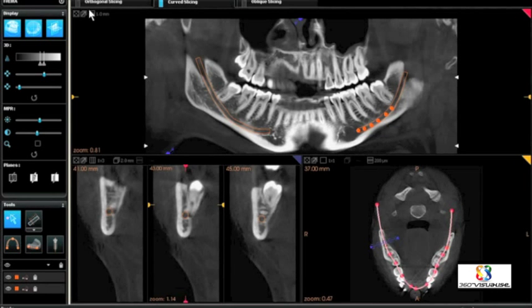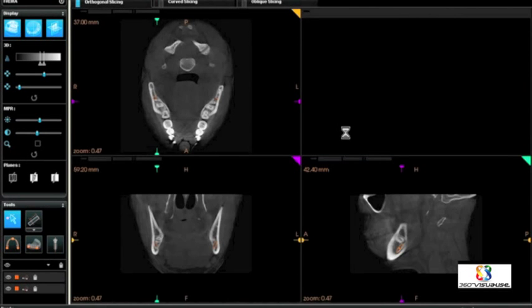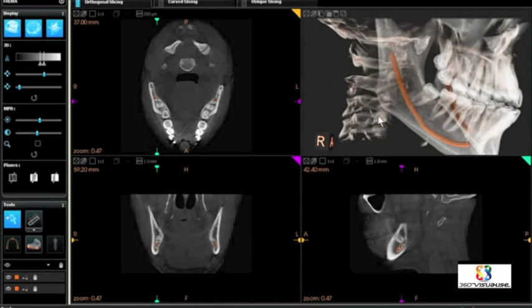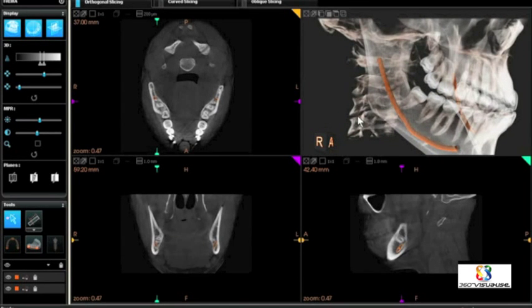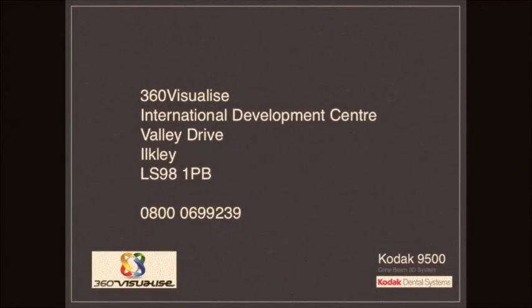At this point, we'll go back to the orthogonal slicing, which allows us to visualize the nerve canal in the three-dimensional volume. As you can see, the nerve canal is also clearly visible in the axial, coronal, and sagittal views. That concludes the short presentation on this particular patient and how three-dimensional imaging really helps to better visualize the patient. Thank you.